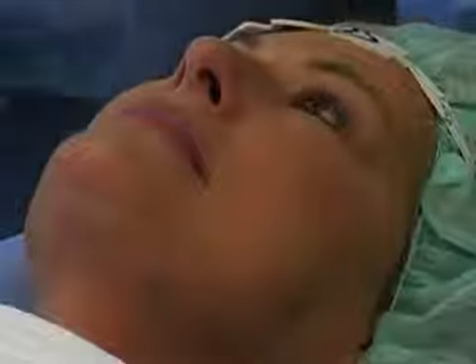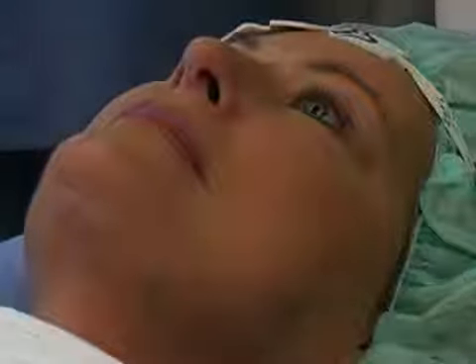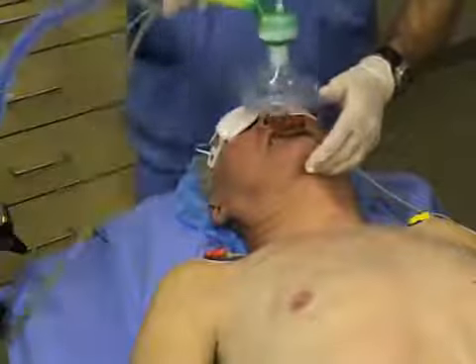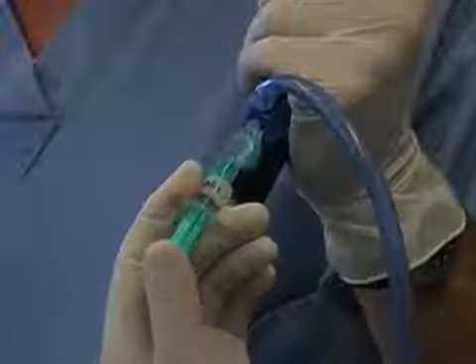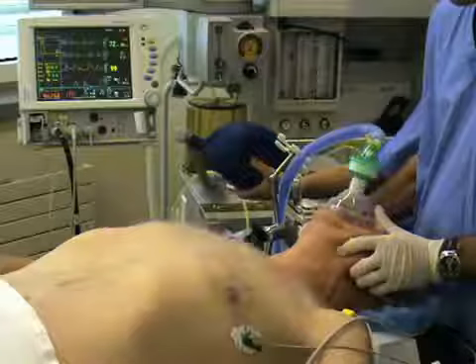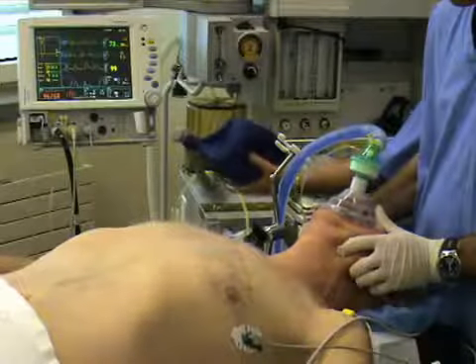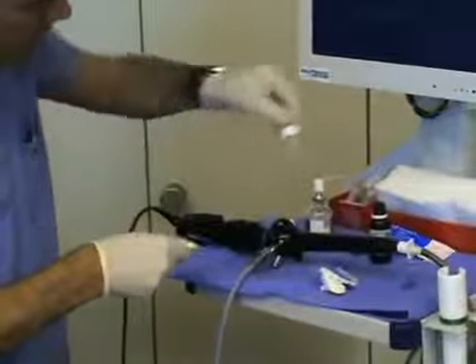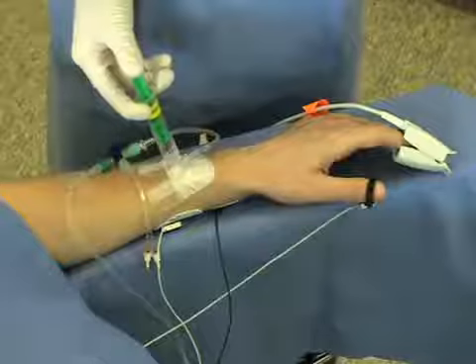Fiber optic intubation plays an important part in the management of a difficult airway and is recommended by many societies of anesthesia. It is primarily important for the management of the anticipated difficult airway, but can also be used to secure the airway in an unexpected situation. There are different techniques for both situations, the nasal and oral approach in the awake and anesthetized status respectively. The choice of the equipment and medication is primarily dependent on personal preference.